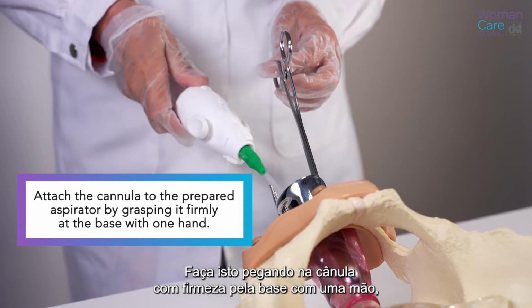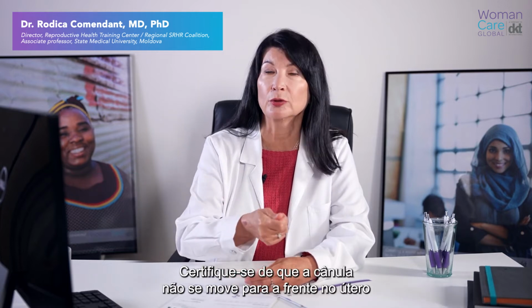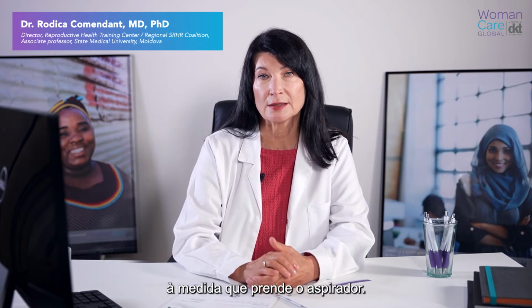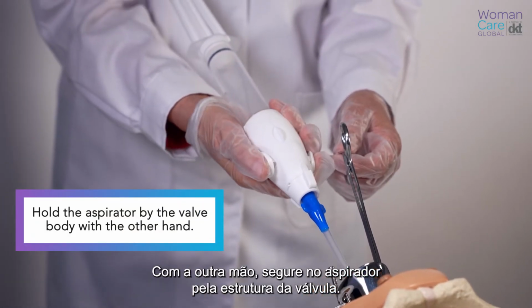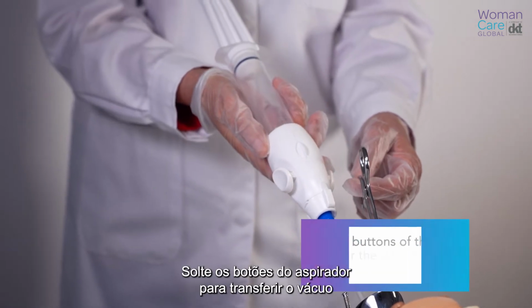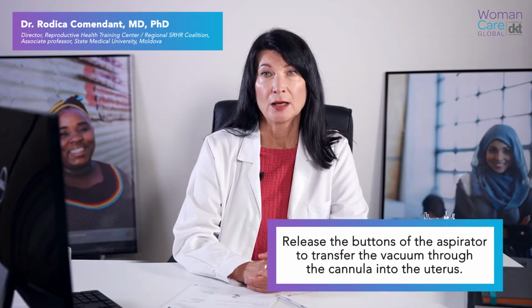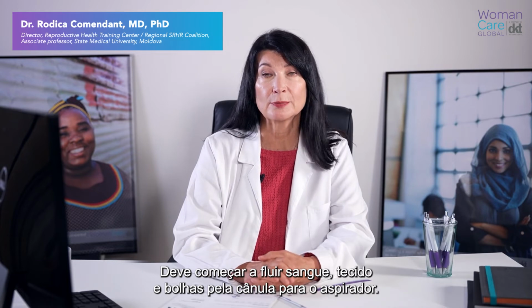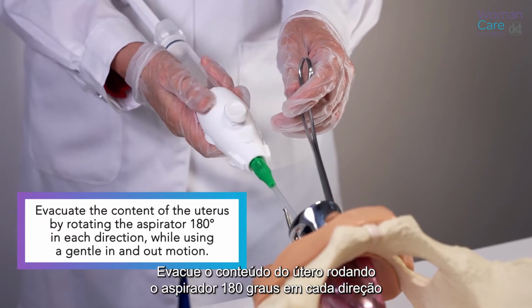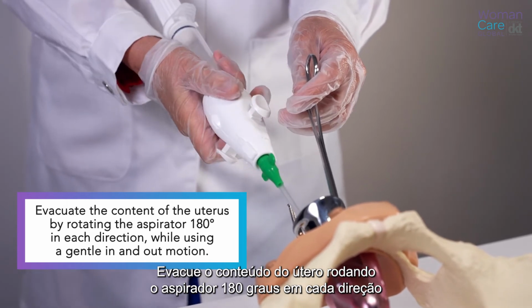Do this by grasping the cannula firmly at the base with one hand, holding it steady. Make sure that the cannula does not move forward into the uterus as you attach the aspirator. With the other hand, hold the aspirator by the valve body. Release the buttons of the aspirator to transfer the vacuum through the cannula into the uterus. Blood, tissue, and bubbles should begin to flow through the cannula into the aspirator. Evacuate the content of the uterus by rotating the aspirator 180 degrees in each direction.